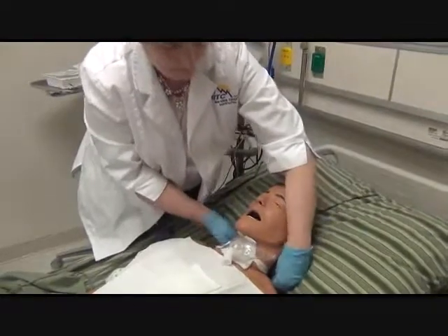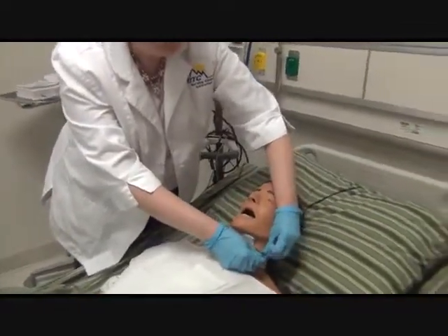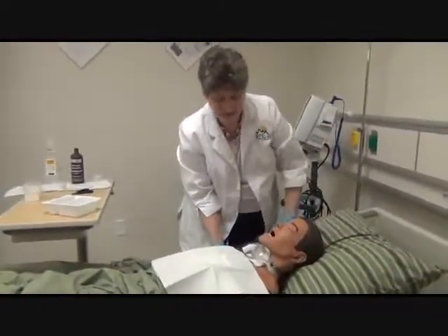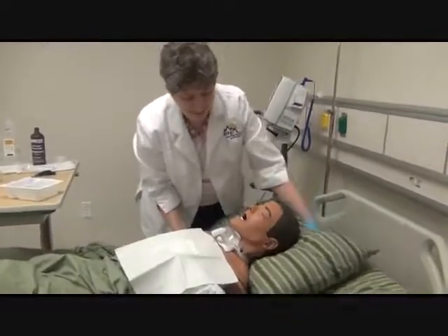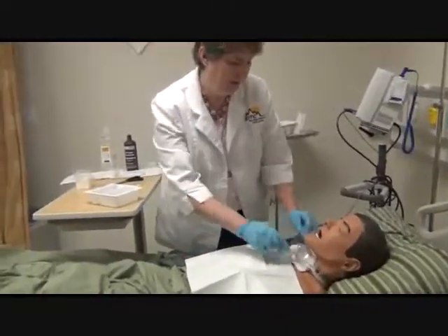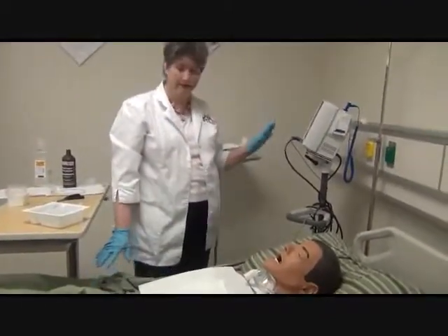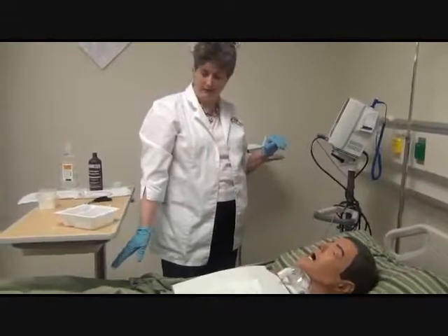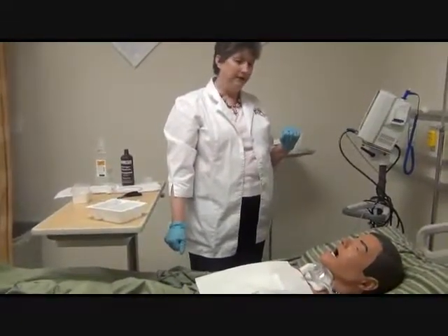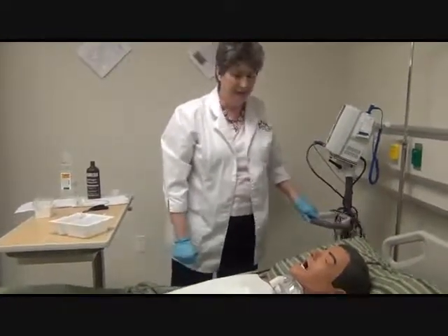We would have throughout the procedure been watching SATs. Make sure your SAT monitor or alarm's on, so that if your patient were to get into distress, you'll have some warning. We're going to situate him, ask him if he's doing okay. Again, reassess his pulse rate, his pulse oximeter. Make sure his call light is in reach, and we're going to, again, put the side rails up.